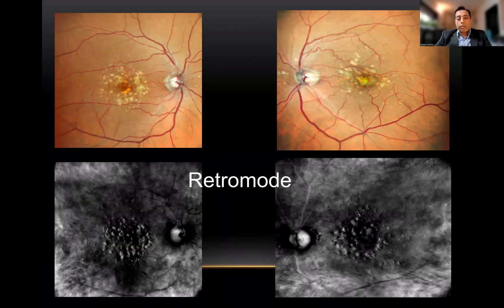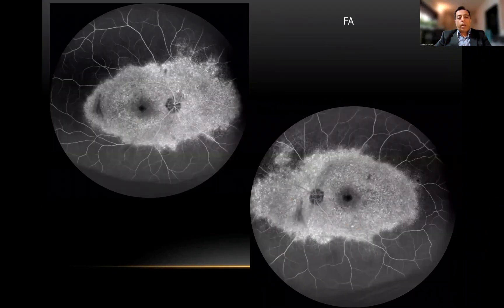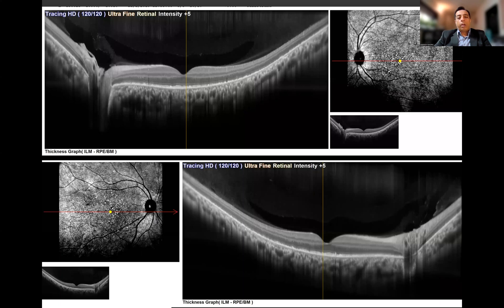Retromode is another aspect which gives beautiful lunar-like crater images of any elevations. Most of the time, the drusens stand out quite clearly and give very impressive pictures. We had a patient of presumed tenofovir toxicity with very subtle macular changes, but when you do the FA you can see how well-demarcated the whole deposits look, and the OCT shows stippling in the region as well to confirm the diagnosis.